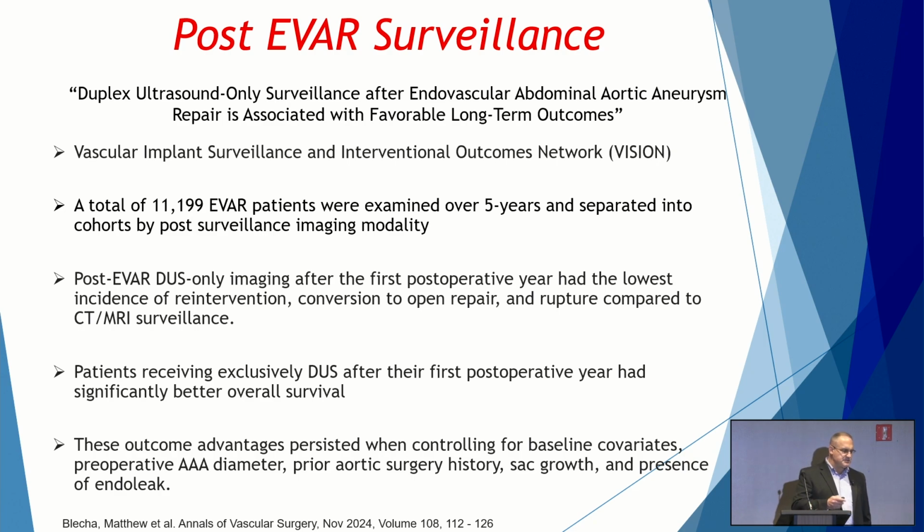The most important thing to take home about this, because I don't think EVAR is going away as a tool, is that it's an excellent tool and the technology gets better and better. I think post-EVAR surveillance becomes a more and more important part of EVAR care. This was a study out of Loyola that looked at following EVAR repairs with duplex only.